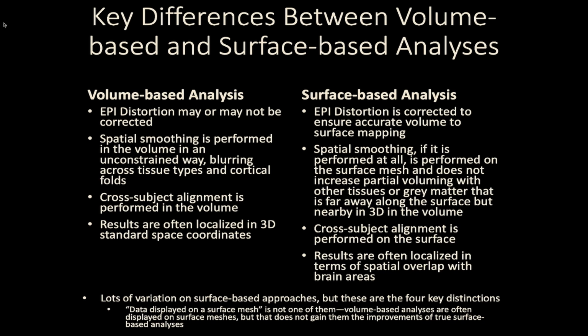Note that I haven't said to do your analysis in the volume and display it on a surface mesh, because that doesn't really gain any of these benefits, and that mapping to the surface mesh is likely not going to be particularly accurate. So to do a surface-based analysis, you want to have done all four of these things, not just do this and then map it onto a surface mesh.